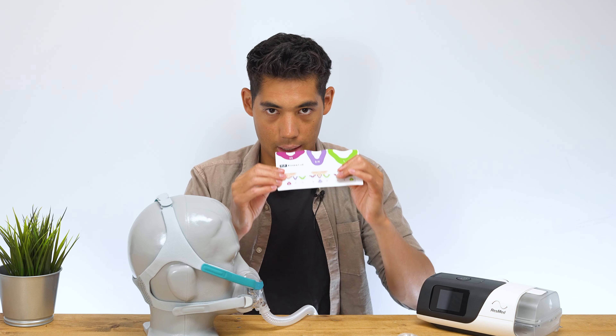As you can see it's a soft material wrapping around the back. On the back we have this mesh material — it's supposed to keep you cooler at the back of the neck. Not sure how well that works if you're lying on your back with a pillow, but it does have some perforation so it might prevent some of the sweat you might get at the back of the neck.